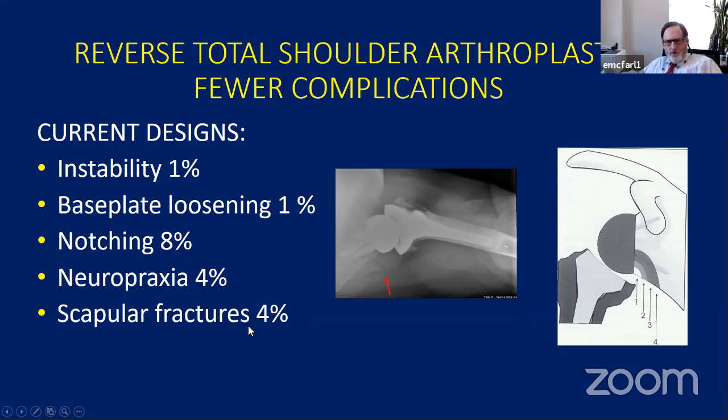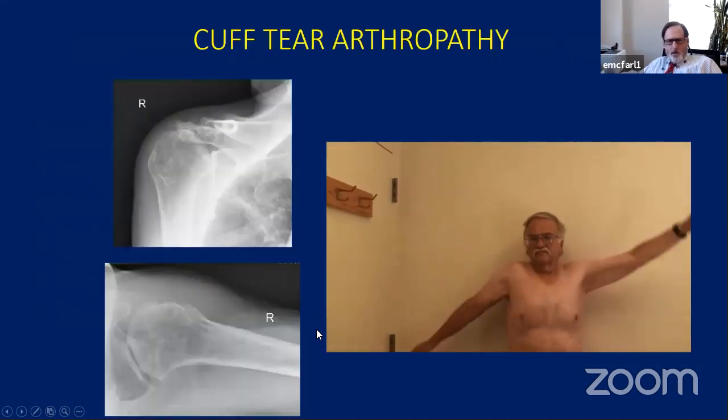Scapular fractures, it's kind of controversial in that some people say it's due to the design of the prosthesis. It's probably multiple factors that cause these, but they can be really debilitating for patients, because if you fracture your acromion or your scapula, then your deltoid doesn't have a good solid fixation, and patients can lose motion. So a couple of quick cases.